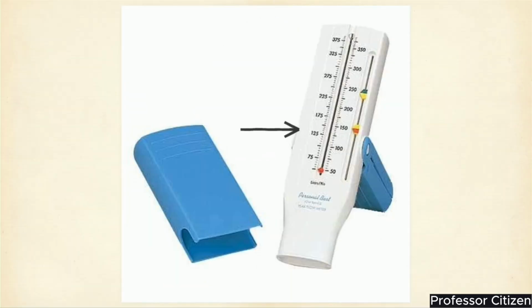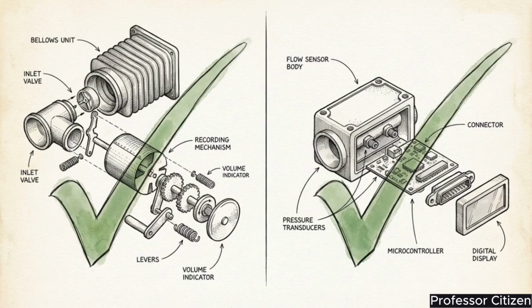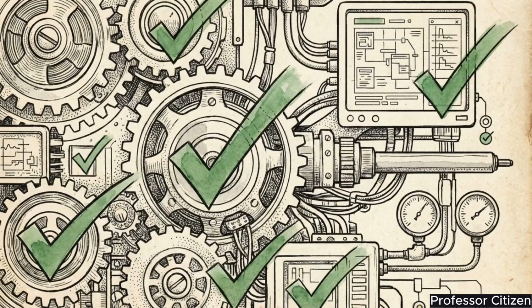This photo highlights a handheld peak flow meter, which also operates under the flow measuring category, to quickly check the maximum expiratory rate at the bedside. Whether you use a mechanical volume collector or a digital flow sensor, properly calibrated equipment will yield the flow volume data necessary for a diagnosis.